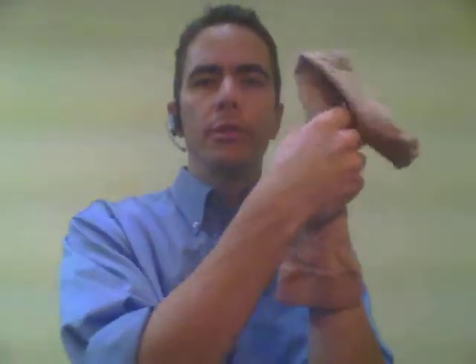I'm gonna demonstrate on my hand to save you from having to see my toes. I'm going to put a sock on top of my hand using the glove. First, taking my glove off, I'm going to show you if I try to rub this on, it's a little bit difficult, as you can see. This is a tight stocking. My hand slides. It doesn't go really fast.